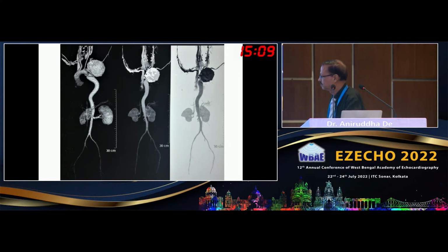I have a question. Mohan, was the MRI necessary after the CT, or could you go on to the next step? It was not necessary. After the CT, the CT aortogram was necessary. But I am giving the follow-up of the patient because at that time he was not my patient. He again came to me with all these reports and then I compiled it. Surgery was done, and this was a true aneurysm, sir.